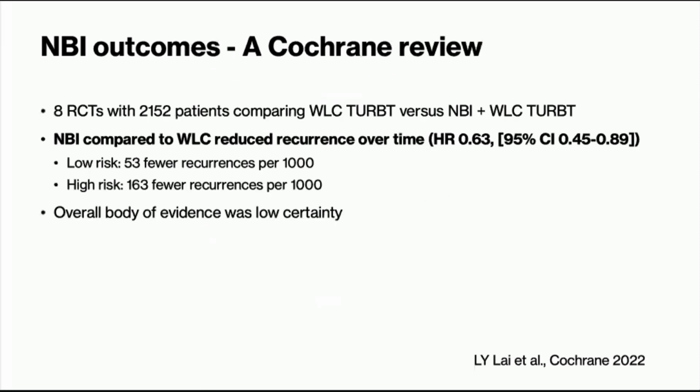This has been studied further with a Cochrane review as well in 2022, comparing 2,000 patients over 8 RCTs. And here, again, they do demonstrate that it seems use of NBI reduces your recurrence over time compared to white light cystoscopy. But the overall body of evidence was low, again, due to heterogeneity in the design of trials, low sample sizes, and some contradictory findings between trials. They did not do an analysis on progression here. And that's something that is still somewhat lacking in terms of study.